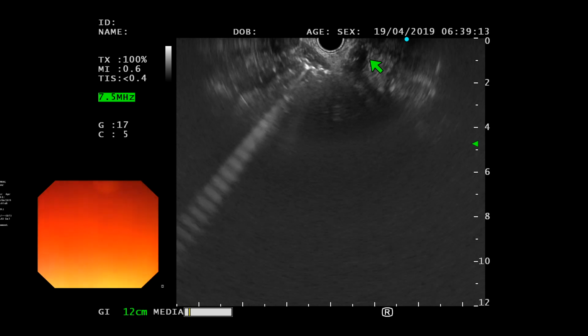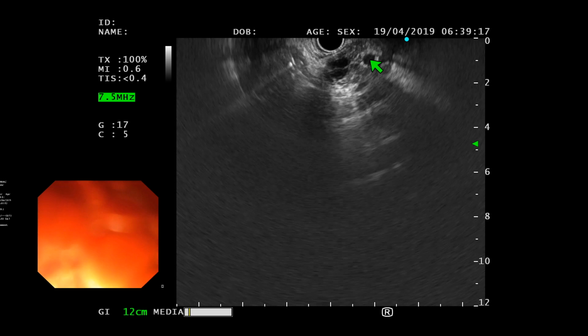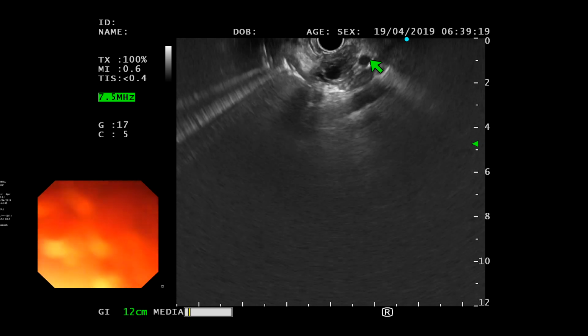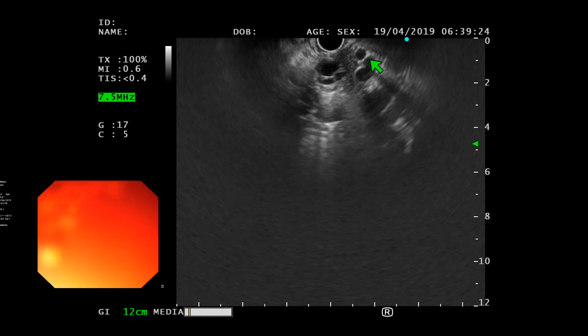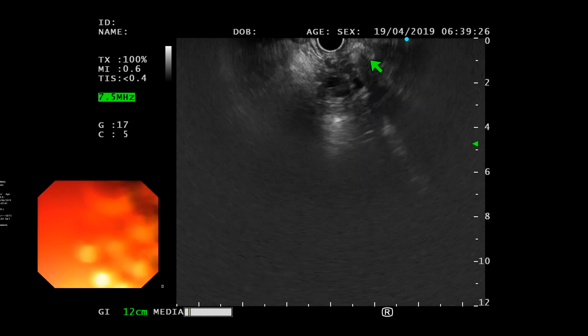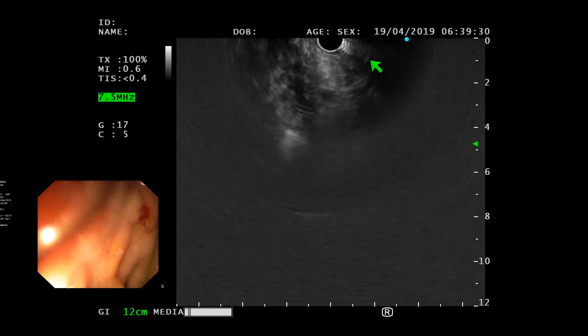Big wheel up and to the right, you're going towards the tail of the pancreas. Big wheel away from you and to the left, you're going towards the head, with a slight withdrawal as well. A slight withdraw, a slight push.